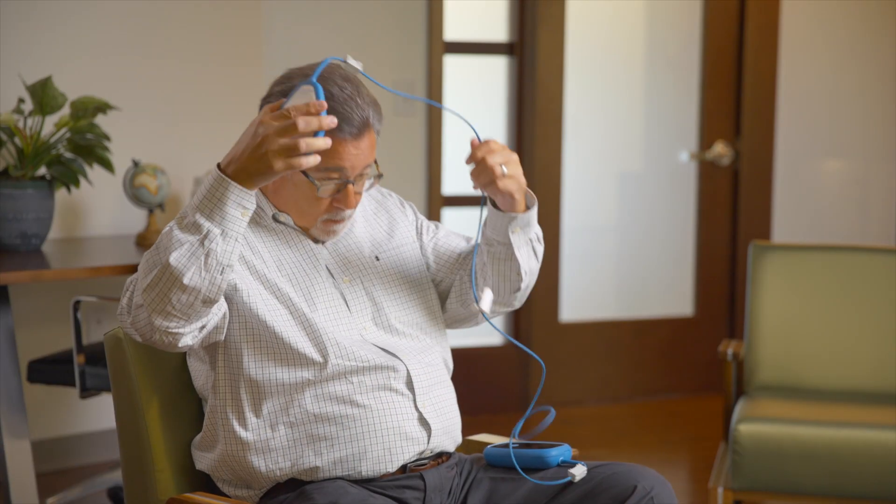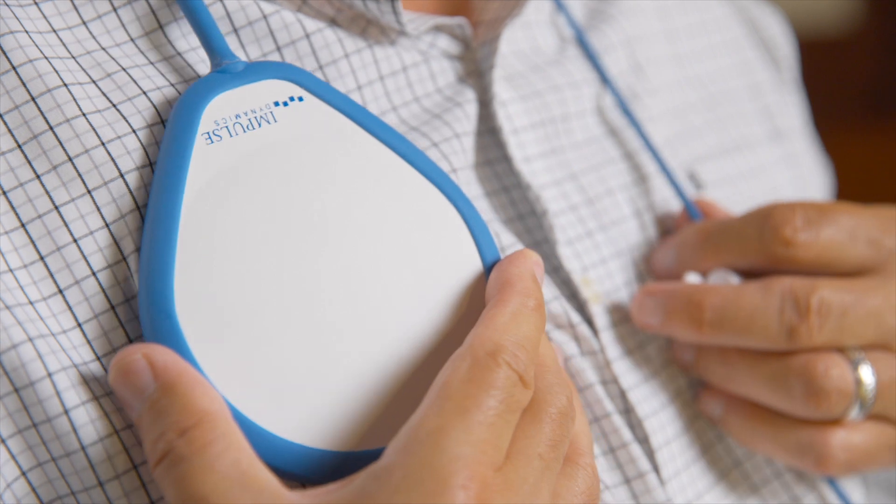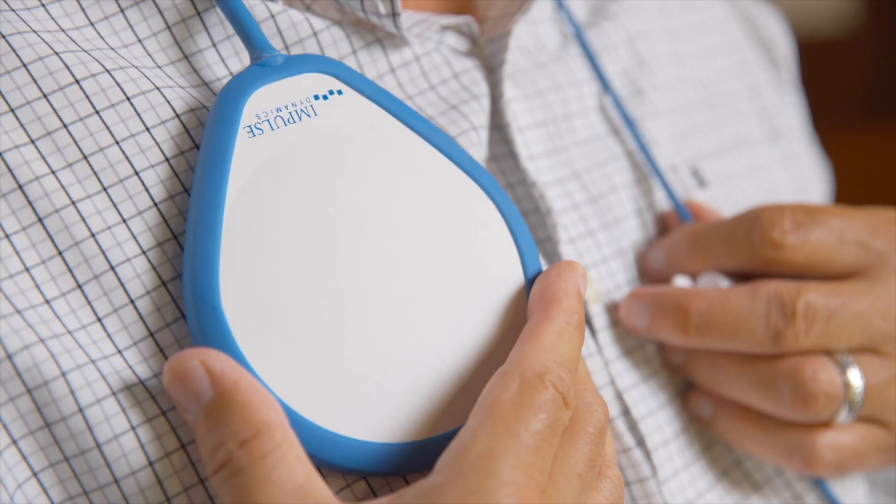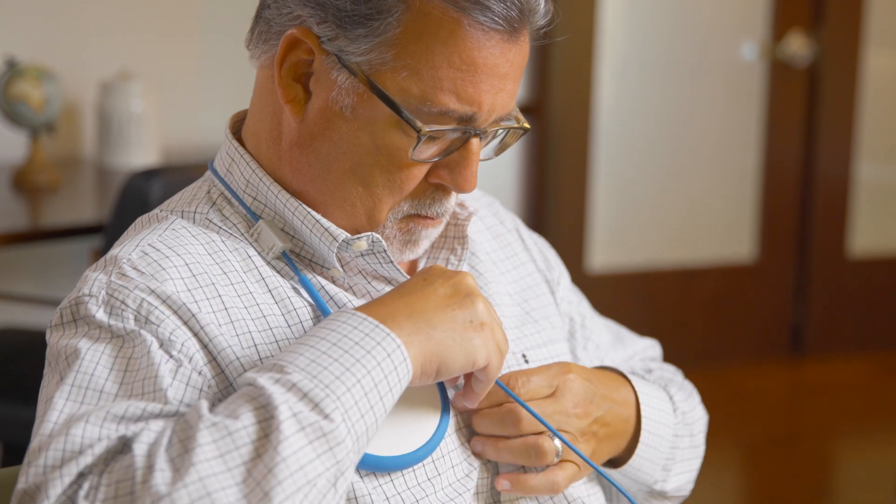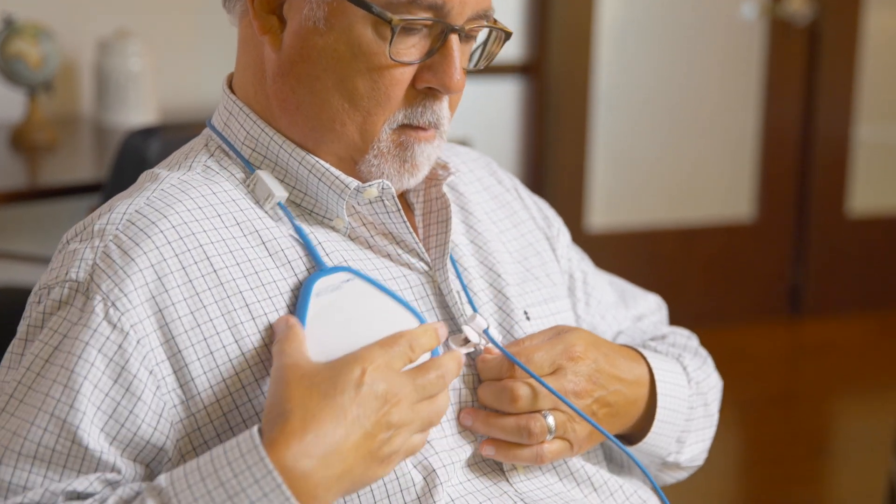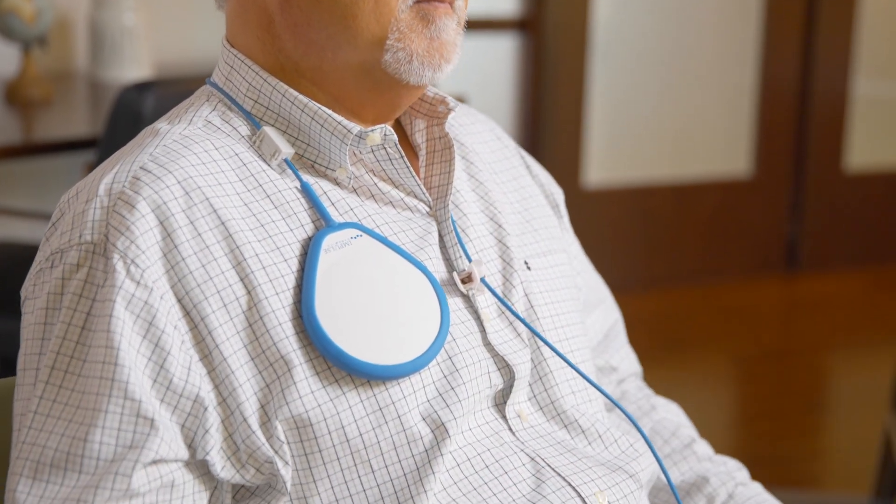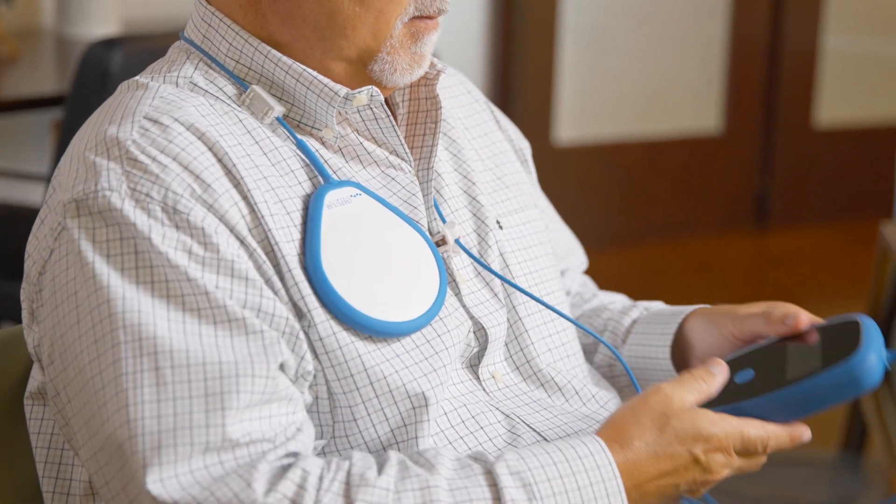While draping the blue cord around the back of your neck, position the blue and white paddle over your Optimizer with the Impulse Dynamics logo facing out. Attach the white clip to your shirt to secure the paddle in place. The charging process will work over normal layers of clothing. You are now ready to start charging your Optimizer.